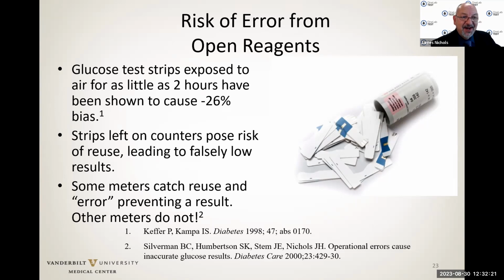The meter we had, however, did not. And so here's a potential risk that we didn't predict in the first place. And had staff been following policy as expected, probably wouldn't have happened. So we went back, retrained our staff, but then also really took a hard look the next time we switched to a new meter. What meter were we going to pick? We were going to pick a meter where it's going to error rather than give a wrong result.